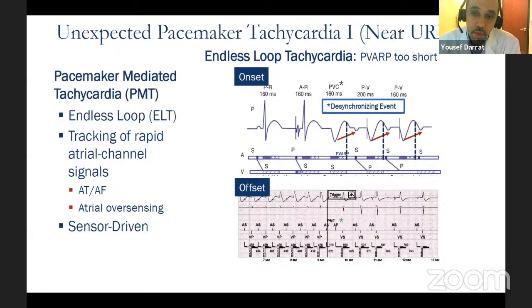That's what I do. But let's say it's a tachycardia mediated cardiomyopathy, someone with AFib, it's obvious tachycardia mediated cardiomyopathy, not pacemaker induced cardiomyopathy. I'm sorry. So someone has normal coronaries, comes in complete heart block, they put a pacemaker in, and then the EF drops down to 30%. Well, if you put a BiV pacer, his EF should improve. So an ICD is maybe not needed there. So Fethi and Khalid, what do you think? Comments about when to put an ICD in those instances?